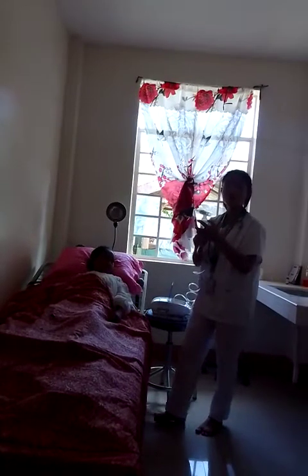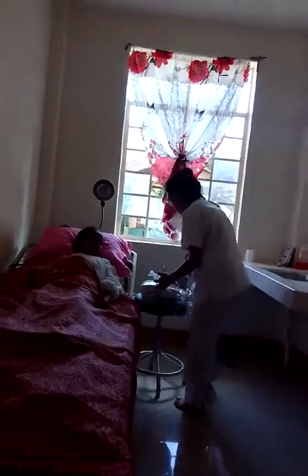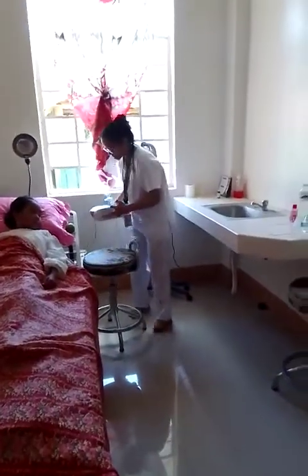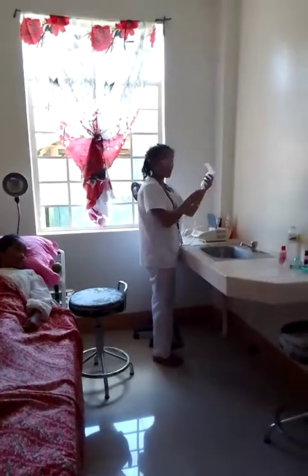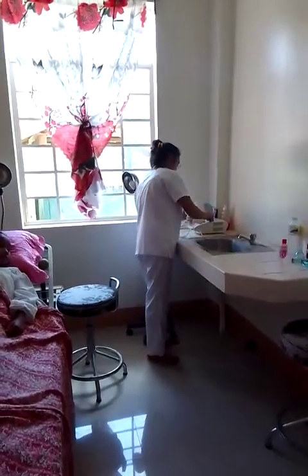Okay, so the medication is finished and there is no residue left. So we need to disassemble this one and then clean the nebulizer after use.